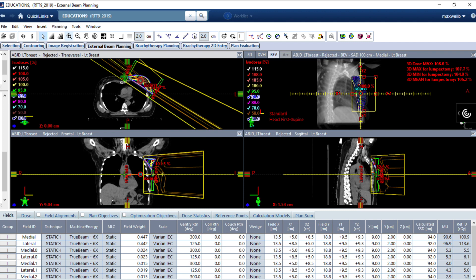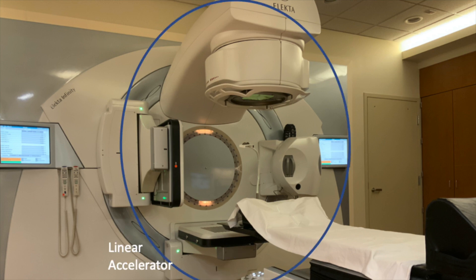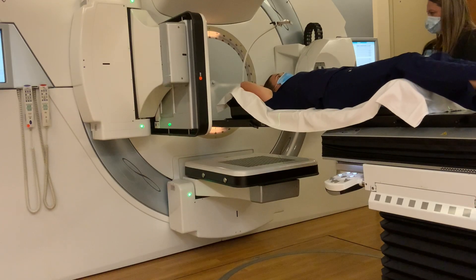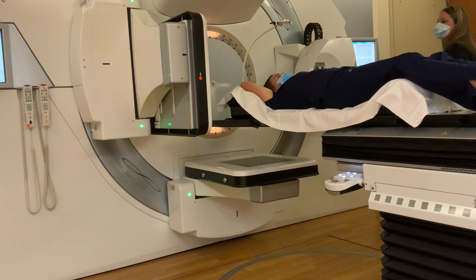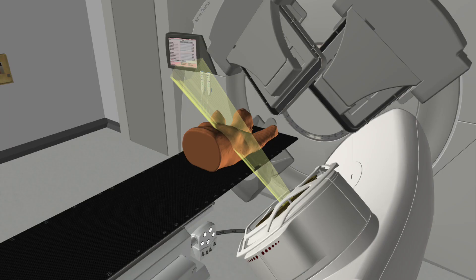This image shows the computer program used to make your treatment plan. This is the treatment room. This is the table you will lie on — it can move in several directions to help us correctly position you. This is the machine, called a linear accelerator. The radiation comes out of the machine here. These are imaging panels. You will lie on the table in your mold and the machine will move to different locations to give radiation according to your individual treatment plan. These images are examples of where a radiation beam might come from and what that would look like on a person.